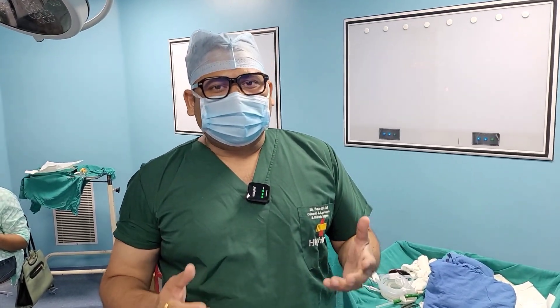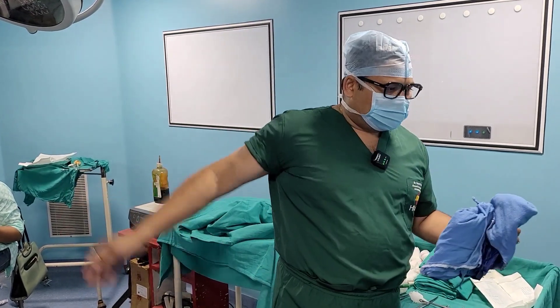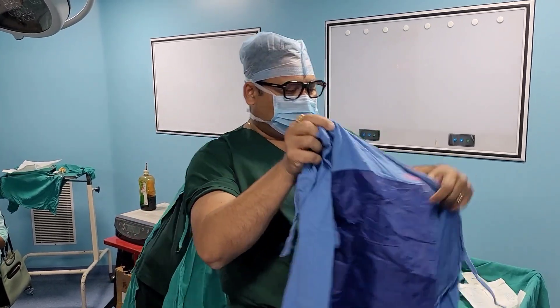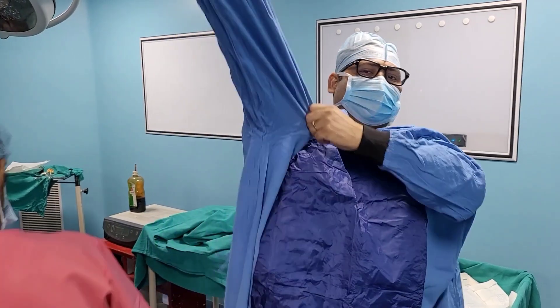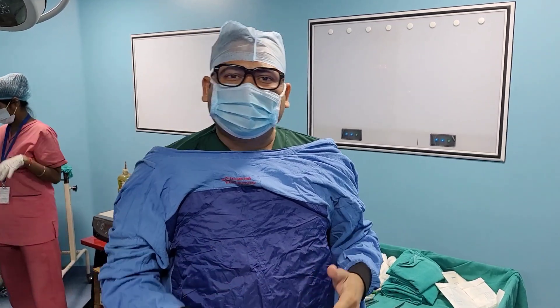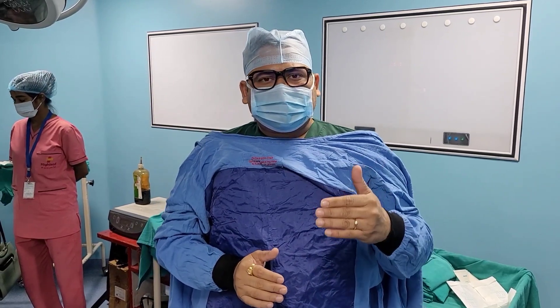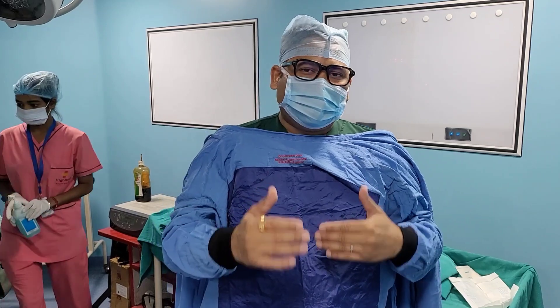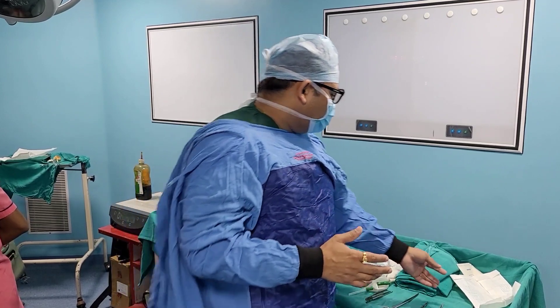I'm planning to go for a right-sided TAPP. What is TAPP? TAPP means transabdominal preperitoneal repair. When we're talking about TAPP, we go via the abdomen — we make the abdominal ports and access the preperitoneal space of Bogros. This is a space between the posterior lamina of fascia transversalis and the peritoneum.